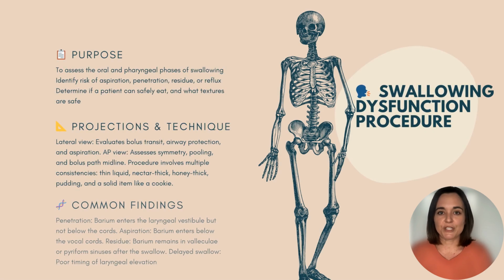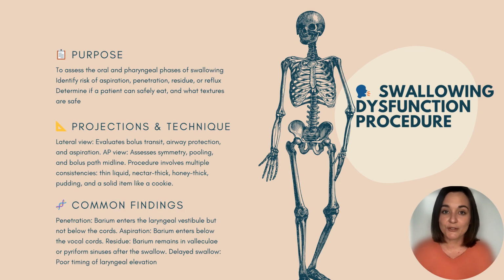Swallowing dysfunction procedure. Let's kick it off with one of the most collaborative procedures in GI imaging, the swallowing dysfunction procedure, also known as a modified barium swallow. Unlike other GI procedures, this one is done with a speech-language pathologist right there at your side. You're not just observing anatomy, you're evaluating function in real time.